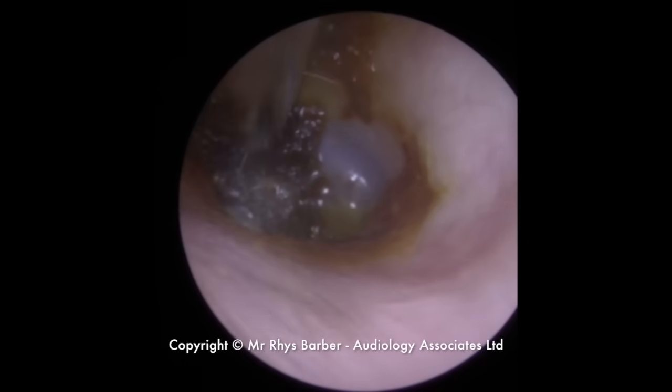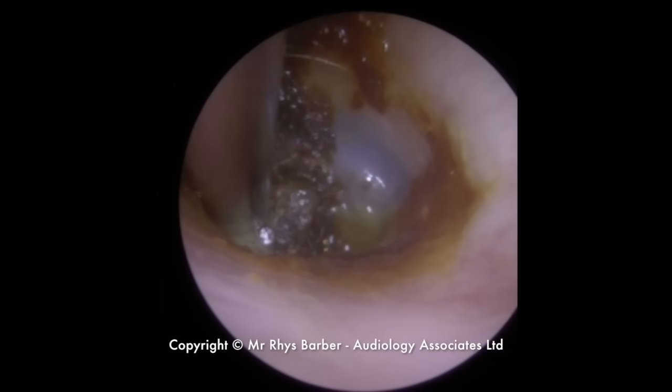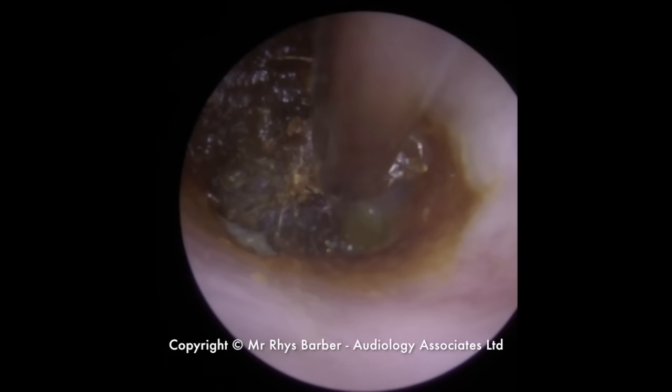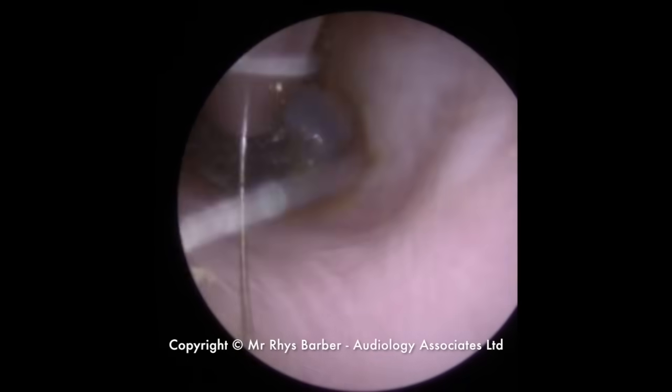So I'm having to go in, take it away. Because the wax is quite hard as well, it's not getting sucked inside the tube itself. It's just sitting on the outer section of the tube, so it just blocks the suction up straight away. So we're having to constantly take a piece away, go back in, take a piece away.